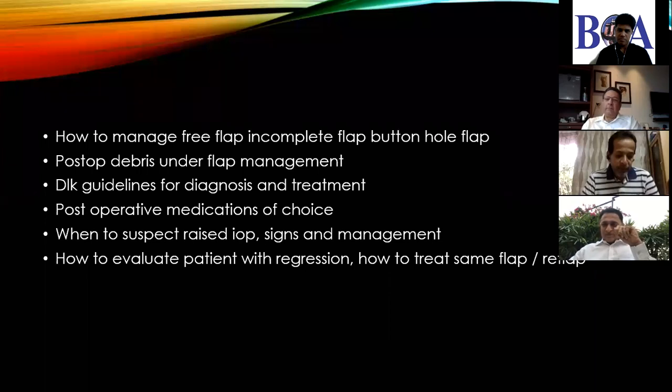The most important thing for suction loss is that the patient shouldn't be squeezing. So one needs to keep talking to the patient, tell him not to squeeze. Because if he squeezes, even with the best of the suction, you can break the suction. Thing number 2 is keep your ears open. It's very important to listen for that little bit of hissing sound which comes when there's a suction loss. See to it that at that time, there is no other sound around. Because if you miss that sound and you advance a microkeratome, you're bound to have a complication with your flap. So keep your ears open. The moment you hear that hissing sound of a suction loss, stop and then reapply the suction.